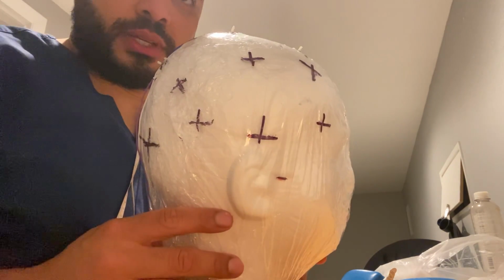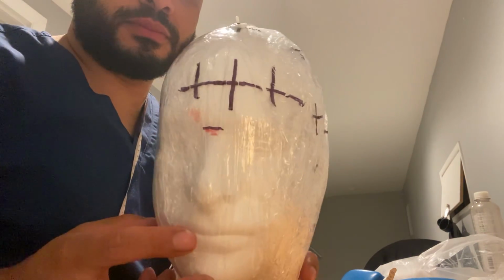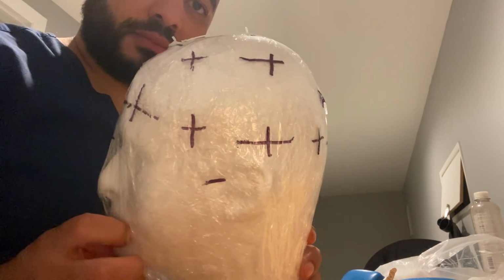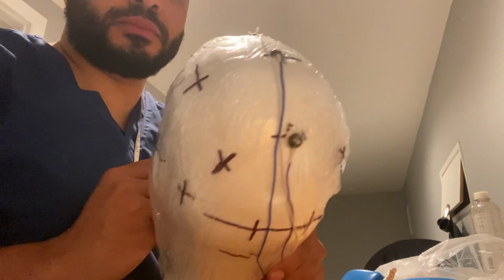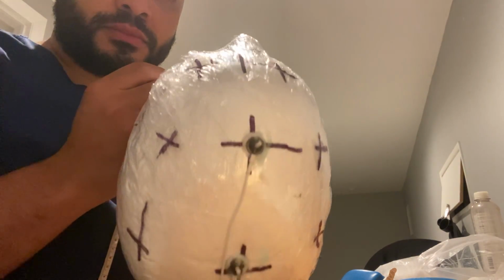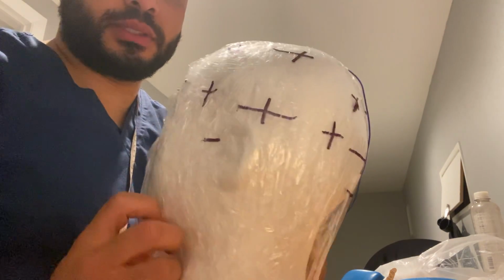So now let's do all angles. And that's it. There you have it.